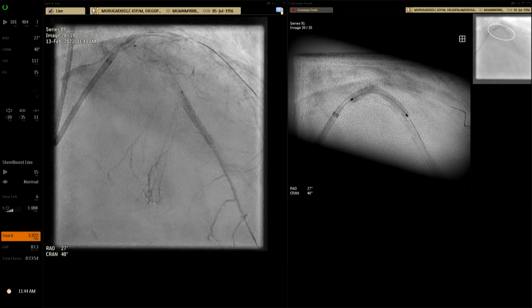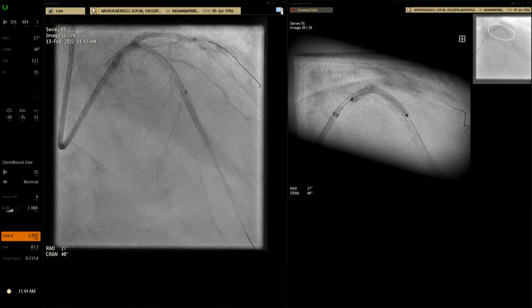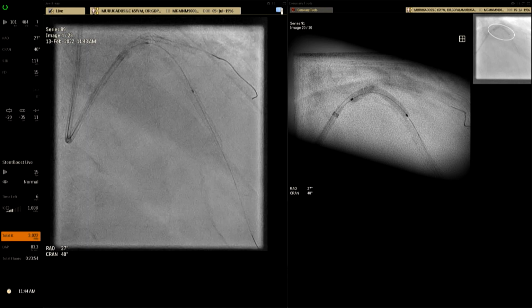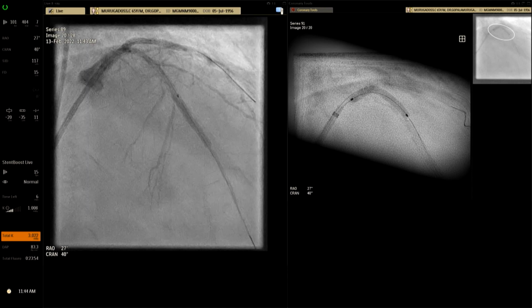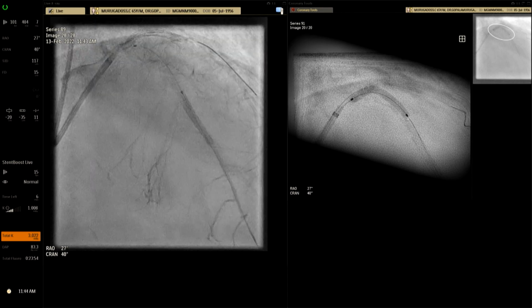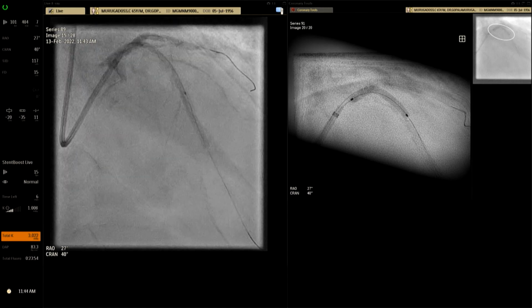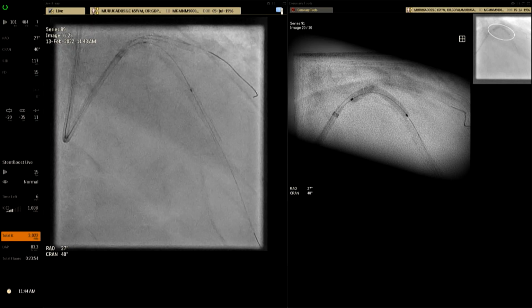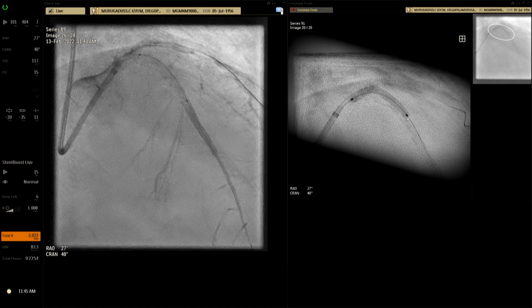We want to cover the left main. So a 30, 32 or 34. We don't mind an overlap distally. There's one 34. Yeah, 34 should go. The overlap distally is very minimal. I think we'll take a 34, please. Just check an ACT for us. And before we put the stent, this wire out and recross.